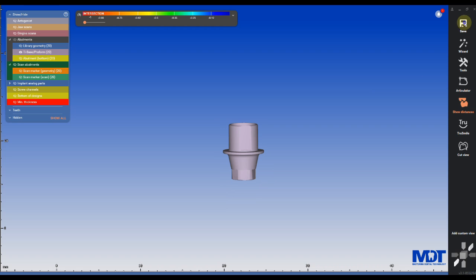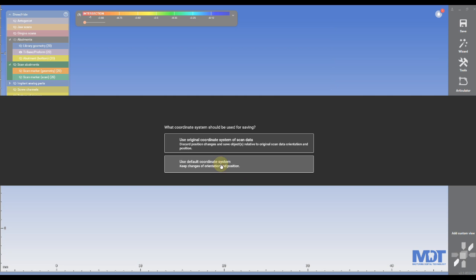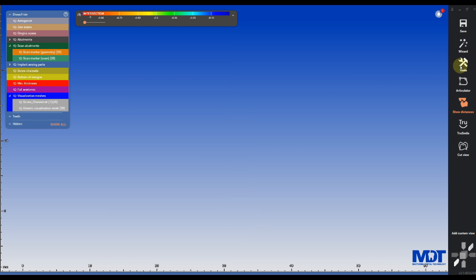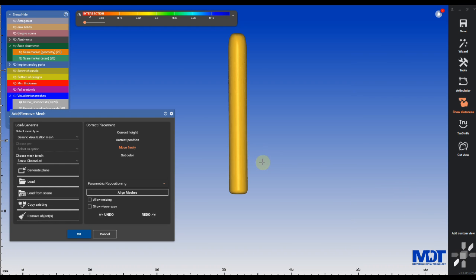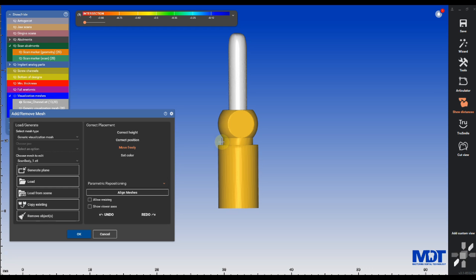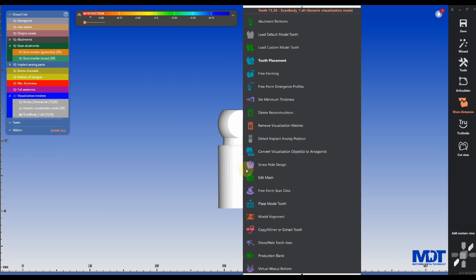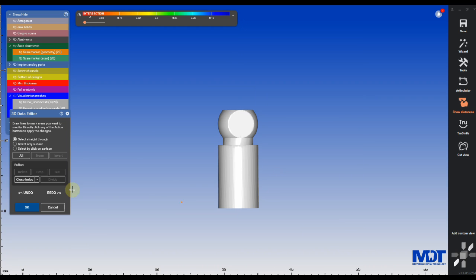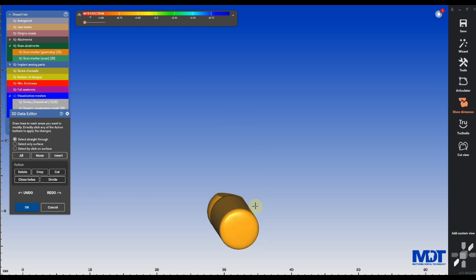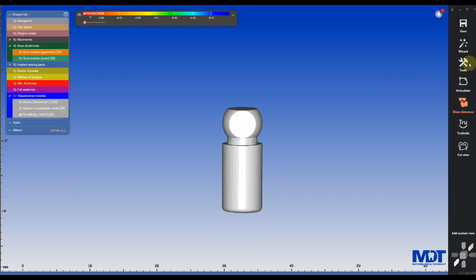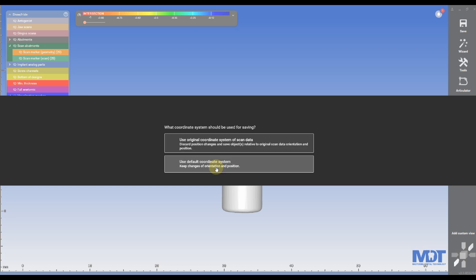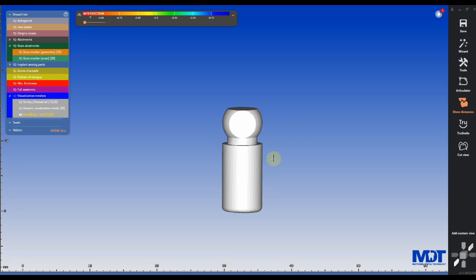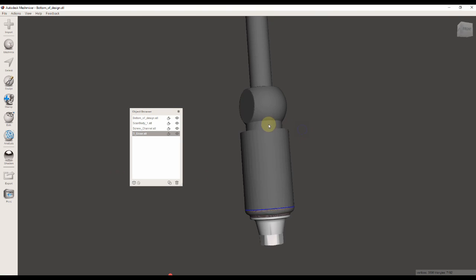The last step that we need to do is reimport the scan body STL and go through the same process what we did with the screw channel. That means right-click on it, click on edit mesh, select all, and close all the holes so it becomes a solid STL where we can later use the screw channel STL to cut a hole through the scan flag to create a screw access hole.